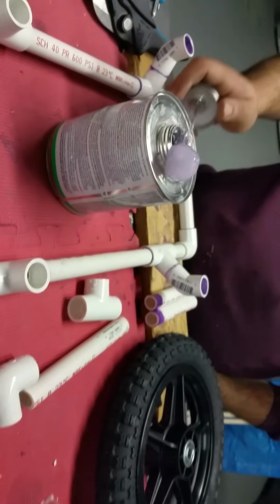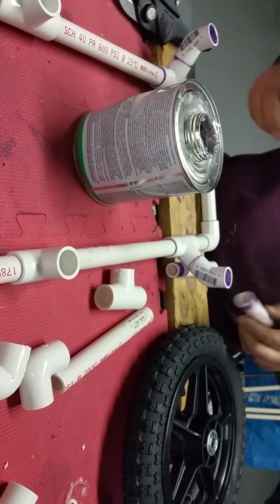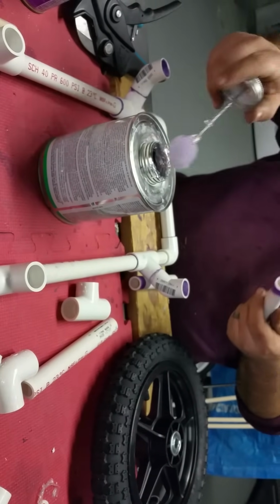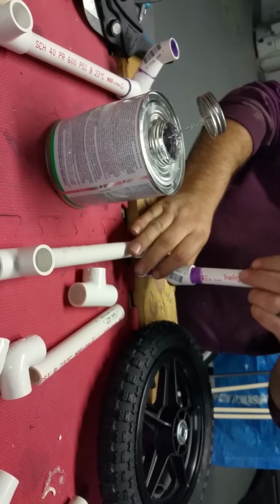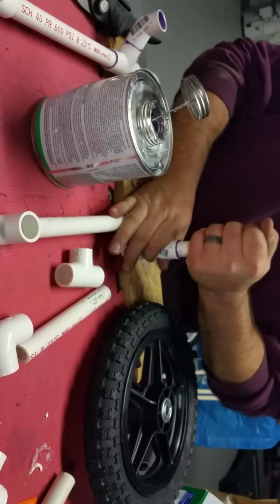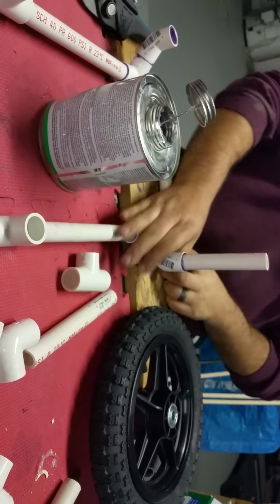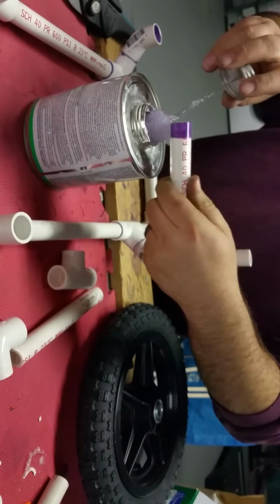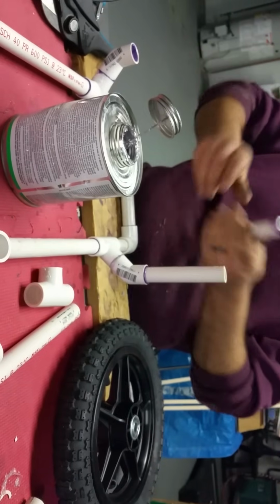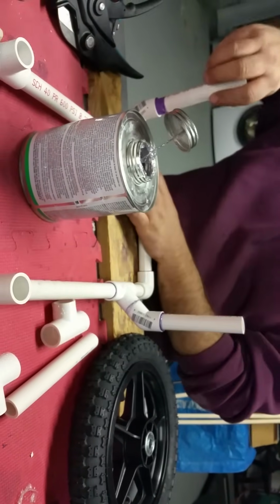So a clearer way for me to say that is we've decided to make the upper section a little bit longer because it doesn't need as much strength as the lower section that is going to be connected to the axle with the wheel. So we've made that 5 inches, and we'll make up that difference in the bottom piece by making it shorter. And this doesn't have to be done. It's just kind of one of those things that as you go, you kind of learn to do.